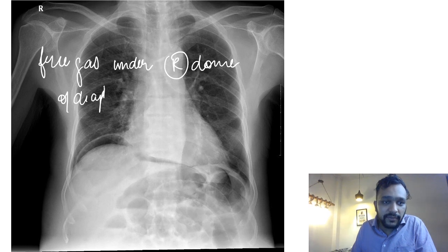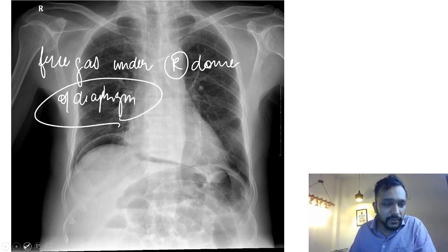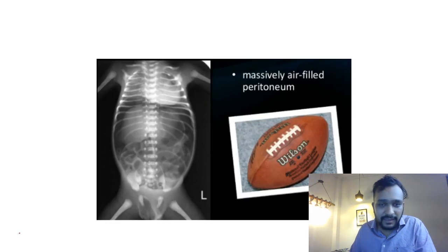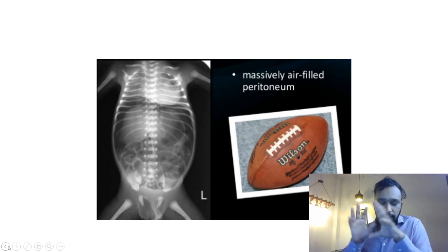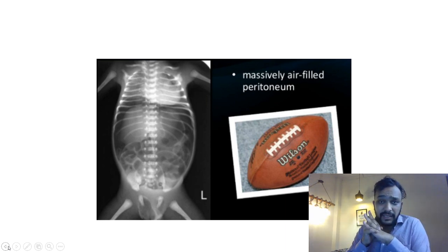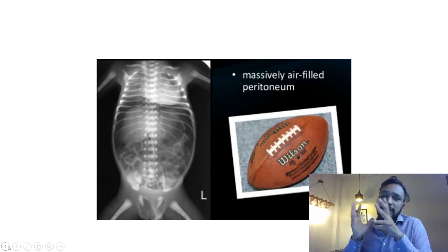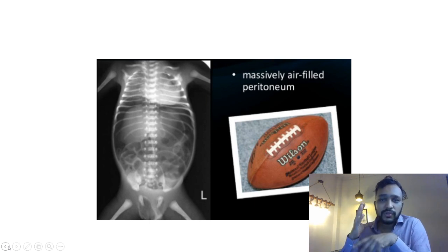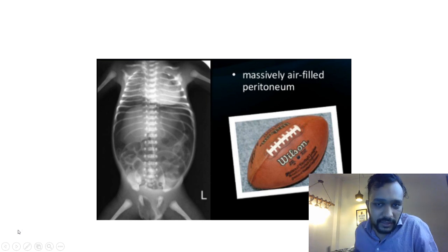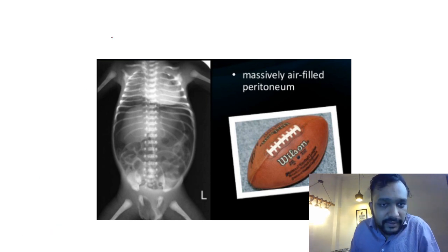This is what you are going to see in a patient with pneumoperitoneum. Normally on an abdominal X-ray you will find a few bowel loops with foci of radiolucency due to the presence of air within the bowel loops, but you will not be able to demarcate any structures. When there is air within the peritoneal cavity, all the structures of the abdomen start to become visible and we can see their borders.